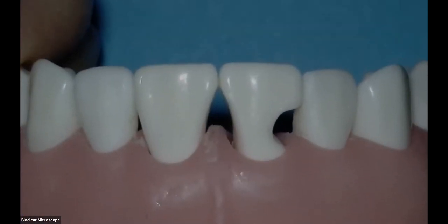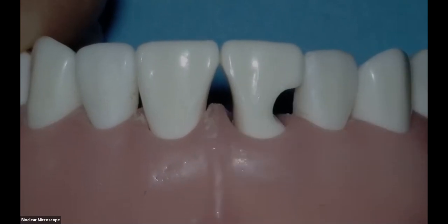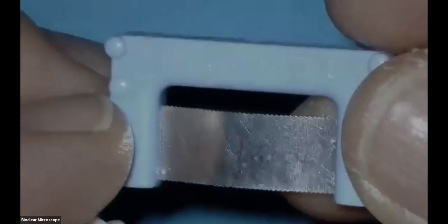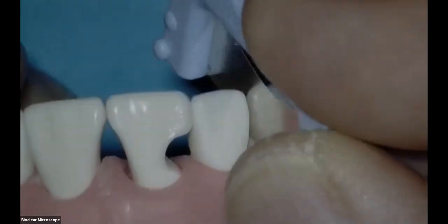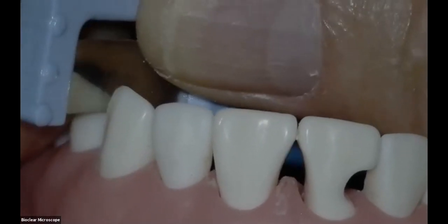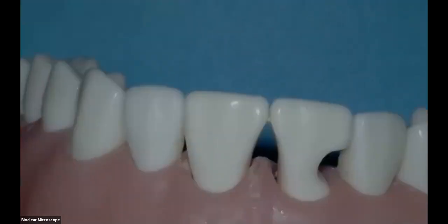So if I were doing this case clinically, I'm thinking about how do I blend, how do I take care of all these things, and then all of the logistical steps about the Bioclear method. The first thing I'm going to do before the rubber dam goes on is take the true contact sander between all the contacts. That allows us to have a beautiful rubber dam. If you don't take the true contact sander through, the rubber dam will tear.